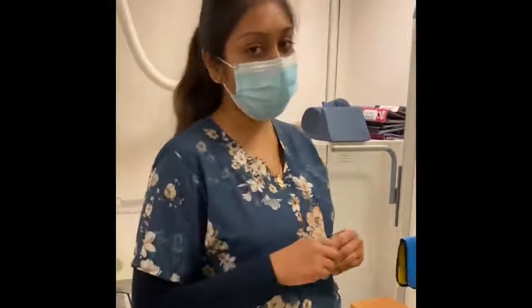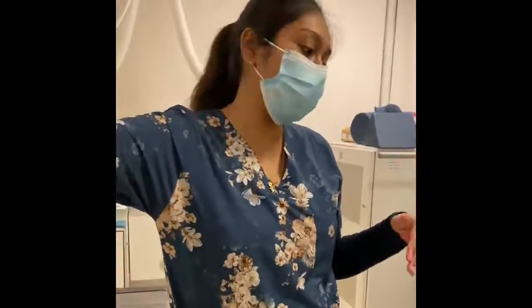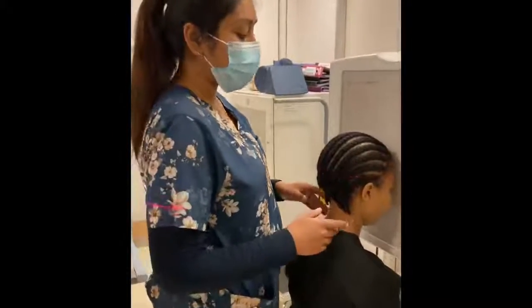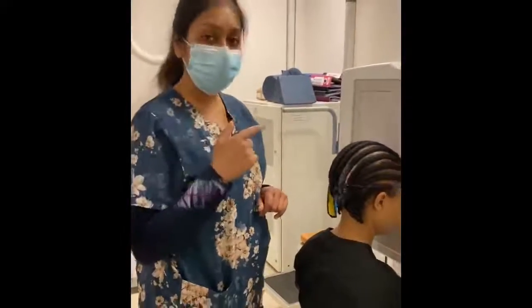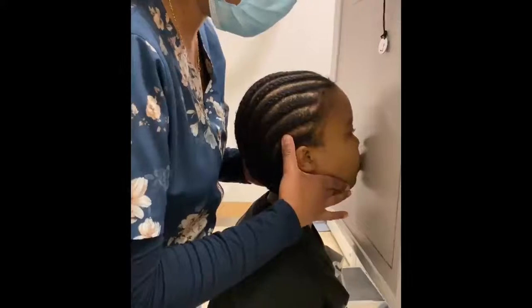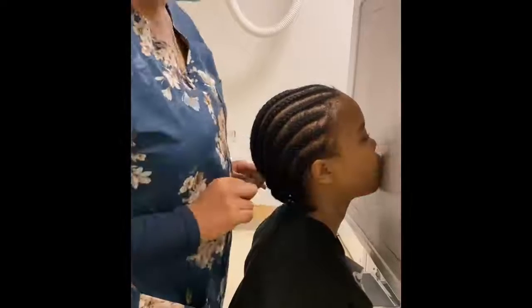So to demonstrate your parieto-orbital oblique, your patient ideally should be lying down on a bed in a prone position so that the mid-sagittal plane is perpendicular to your image receptor. We need to adjust the patient's neck so that the AML, which is now your acanthiomeatal line, is perpendicular to the image receptor. So we're just going to feel just below the nose to the meatus, so perpendicular. So our patient's line is more or less perpendicular to your image receptor.